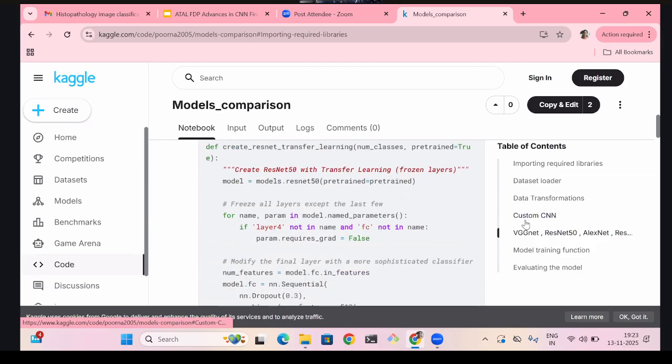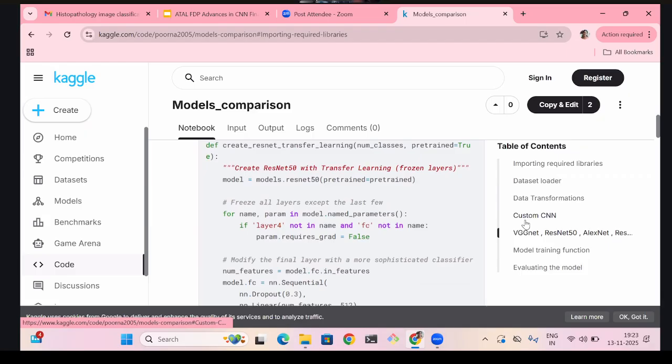The next variation is we froze the weights the ResNet 50 model has learned till layer 3, and we unfroze from layer 4. From layer 4 we unfroze all the layers, and then fine-tuned the ResNet 50 for our bone fracture data set.